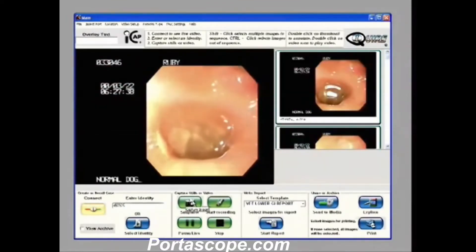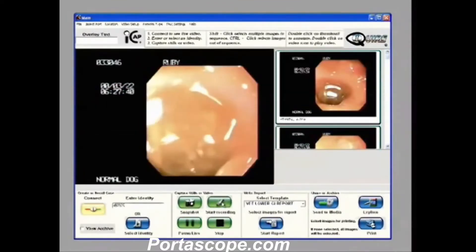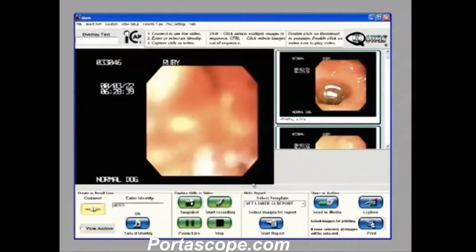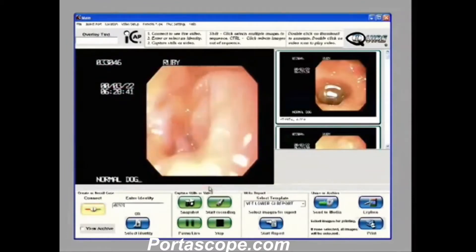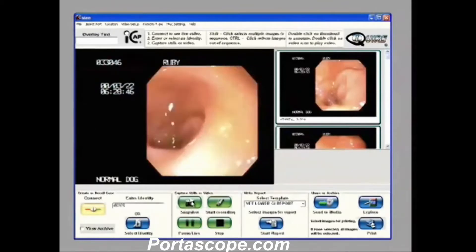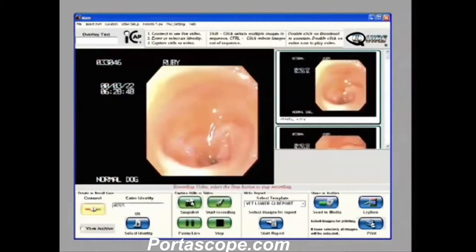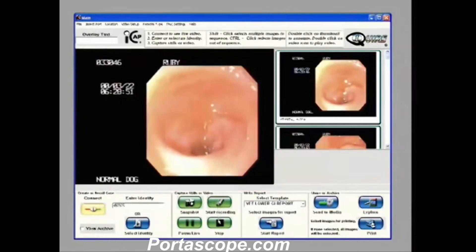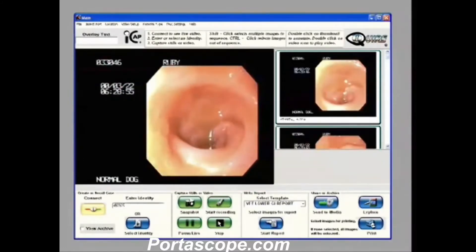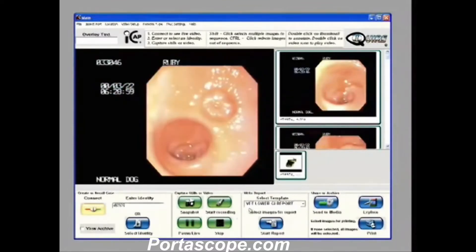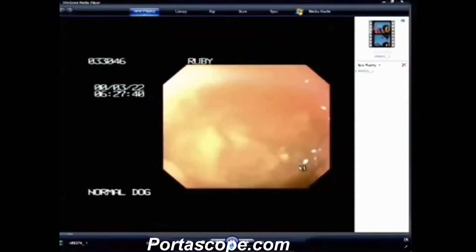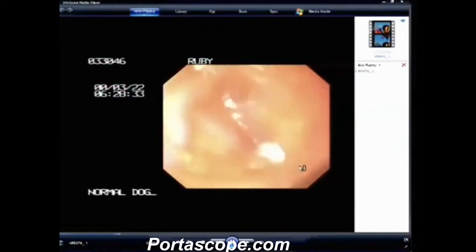If you want to record video, all you have to do is hit the start recording button. Here you'll see it's flashing on the screen that video is being recorded. And while the video is being recorded you can still take snapshots. When we're done recording our video we simply hit the stop video recording button. A little icon was created — this is our video icon. We double click it and it launches our playback and we can see the video we just recorded.